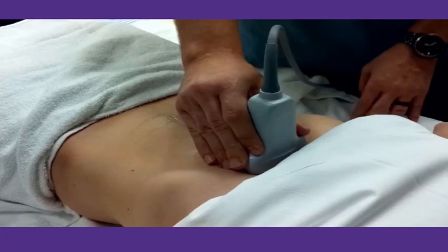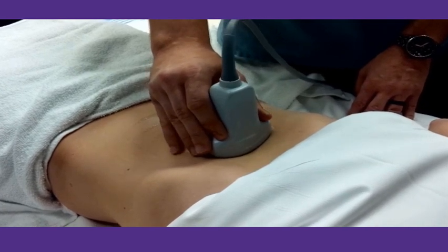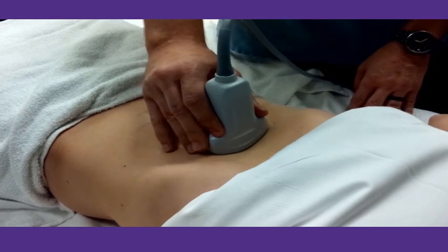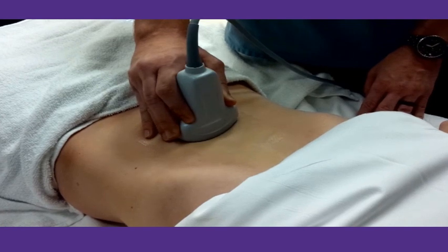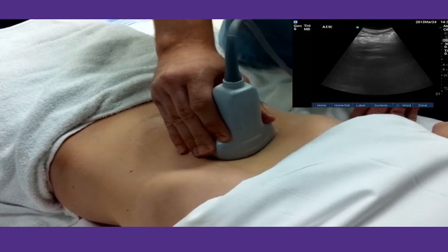It is possible to improve your images by trying a few techniques to temporarily displace the interfering air. The first technique is to apply some firm tonic pressure with the probe and wait for the air to peristalse out of the way or for the bowel loops to be displaced away from the ultrasound beam. Once applied, be sure to be patient with that pressure. It can take several seconds before the air pockets begin to move and the desired image appears.